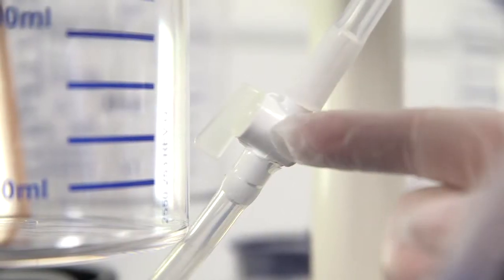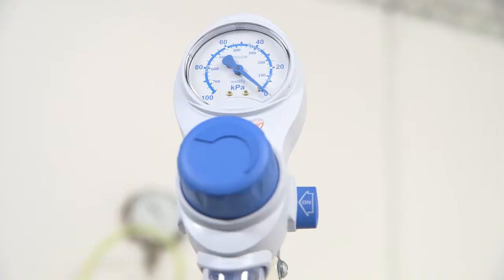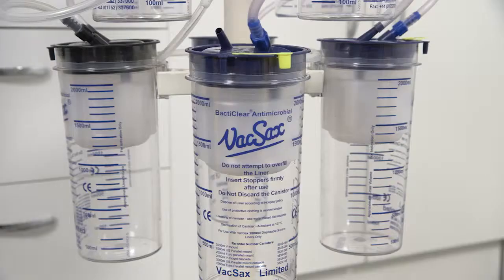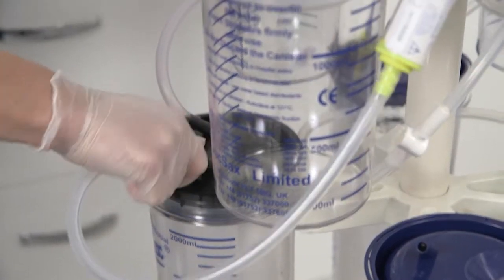Now ensure the bottom siphon tap is set to open and close the top siphon tap. Switch on the vacuum and set to high. Wait until all the liners have expanded into the canisters.